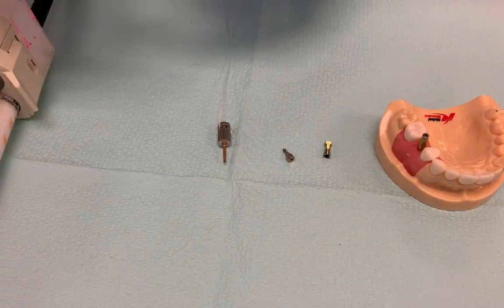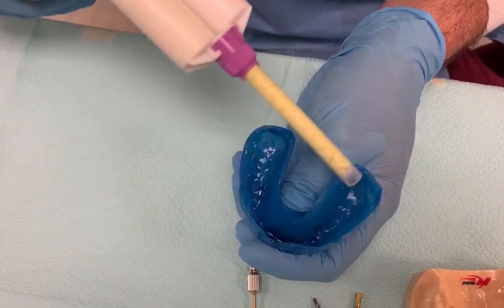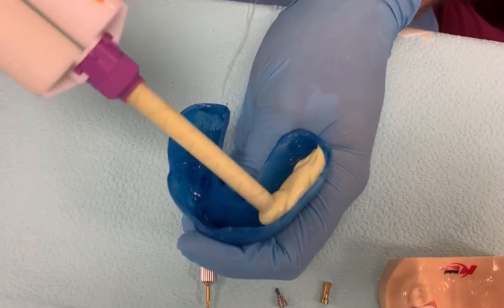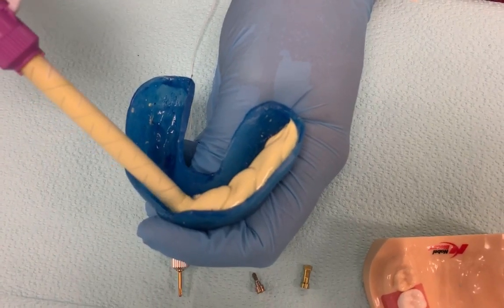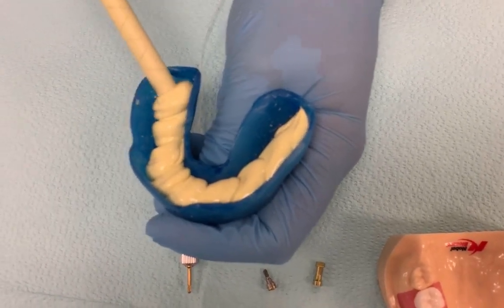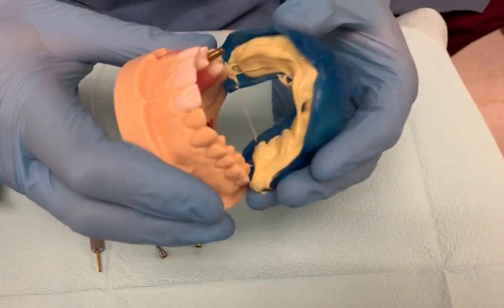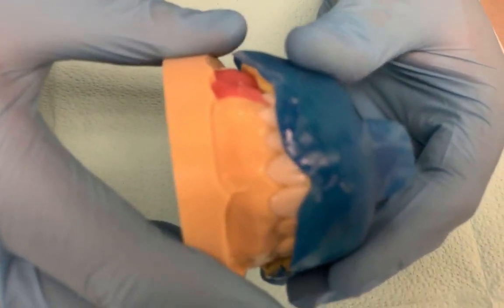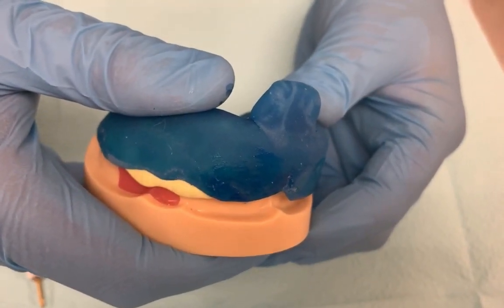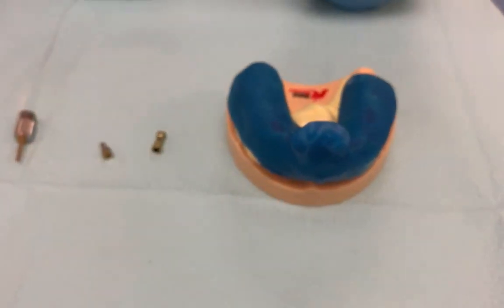Now we will take the impression. The custom tray already has that adhesive on it. And then you just take the impression from the posterior and very slowly move down to cover the anterior. And then you wait five minutes for it to set and you'll have your impression.